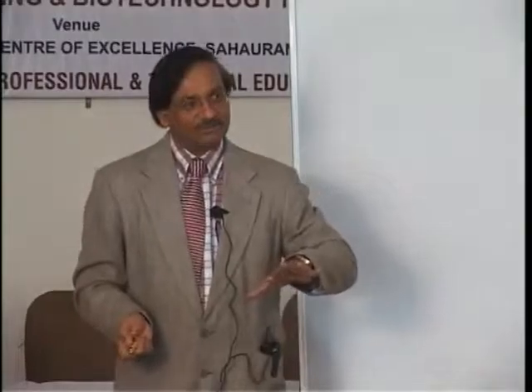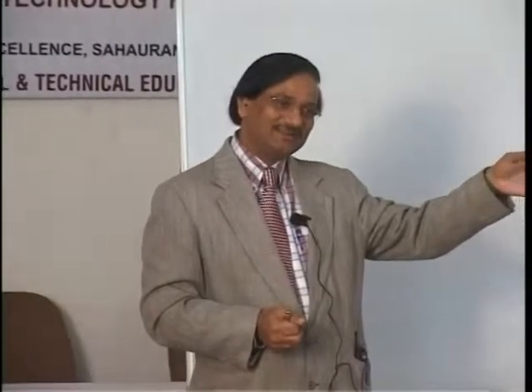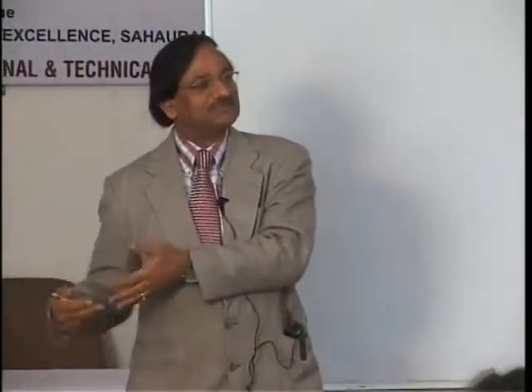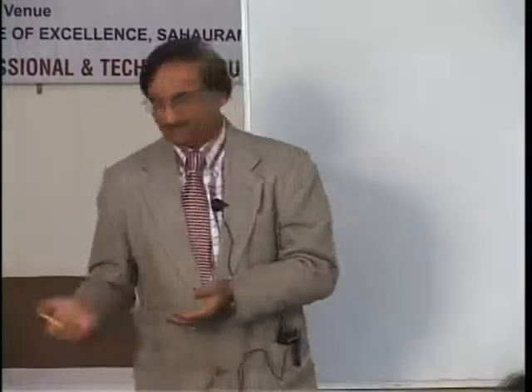Pathological uptake, we know this is what should not be there and is there. That is what is called pathological uptake. A diagnosis comes from knowledge of the normal anatomy and physiology, and an abnormal variation, and finally what we understand from our experience is what is pathology. What should not be there is there. Next.